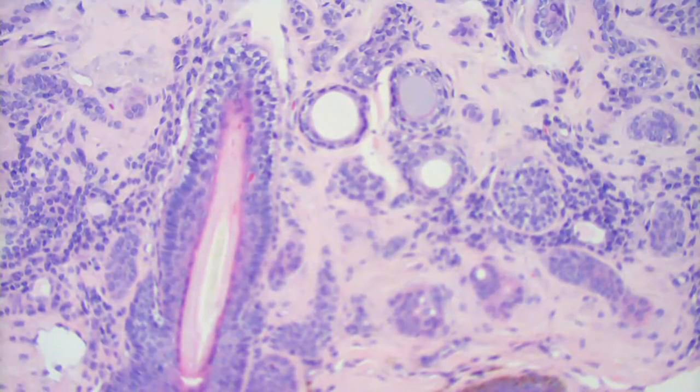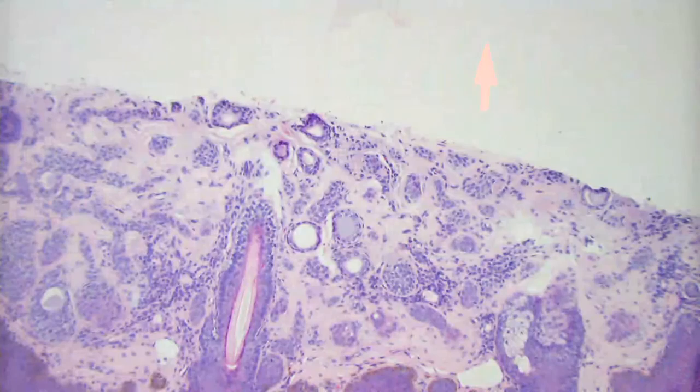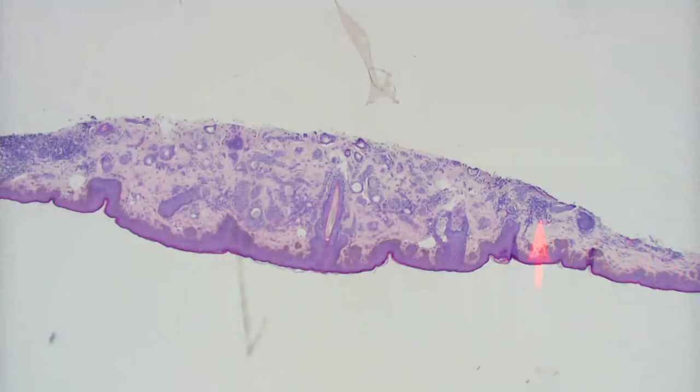And those, as you know, are usually you need a deeper biopsy. But theoretically, you could see this in the superficial component of the MAC, but the overall lesion looks like a fairly small little papule. We don't have the whole thing, but it looks like it most likely was probably something about this size. Looks like it didn't go past this area, and it probably would have been about this. If you completed the circle, probably something like that.